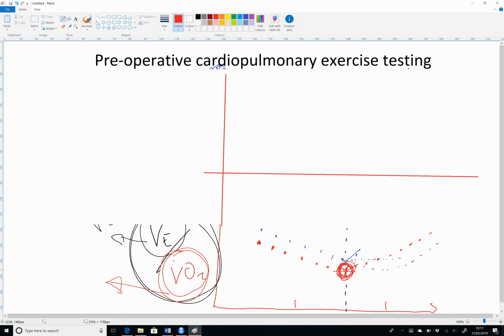What that means is the air you then breathe out has had a lot of oxygen sucked out of it. So the partial pressure of oxygen in the exhaled gas will also reach a nadir at a similar point. Then as you hyperventilate in relation to oxygen, it will go up again.